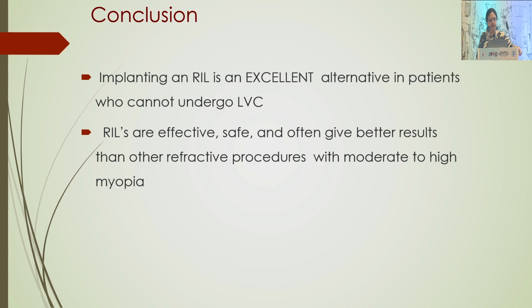So in our very small series of patients of RIL, we had excellent results, and definitely it's a very good alternative and should be considered in patients who cannot afford imported lenses. The results are very good, very safe, and excellent in our hands.